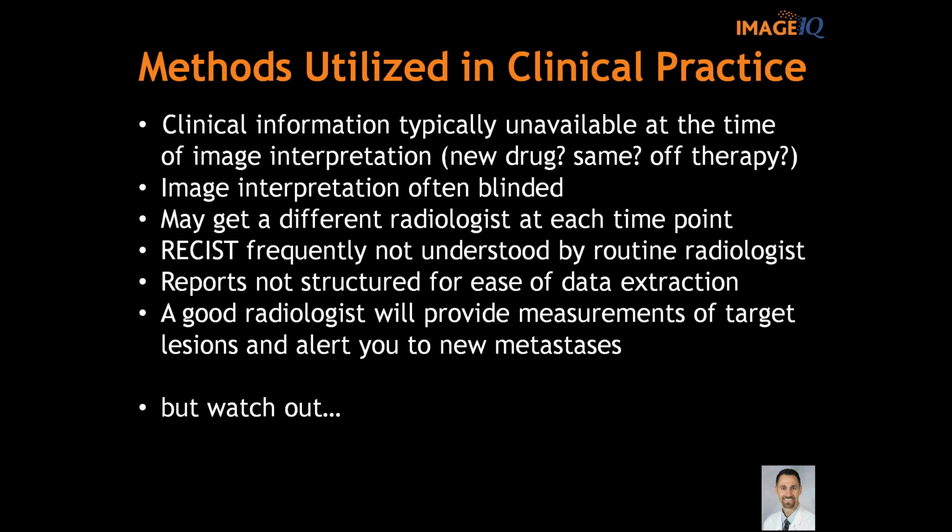Ideally, they'll pick the same one. We tend to do that. But they may decide to measure it a little bit differently. So long as they're measuring the longest dimension, that's fine. It doesn't have to be in the upper left to lower right sort of concept. They just have to pick the longest dimension. But sometimes you get a lot of variability in how someone would define the longest dimension. Imagine a spiculated nodule or something like that in the lung. It's very difficult to reproducibly do that, especially if you switch who's making the measurement.